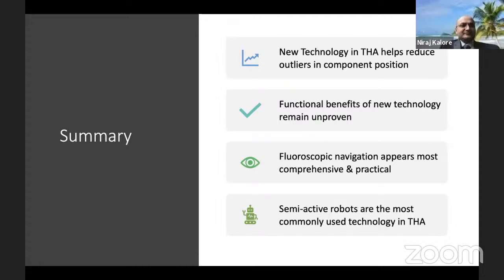Probably different. And out of the new technologies that you mentioned, what is the one that you use or would prefer in your OR? So we have the Velys navigation that is ready for use this year, and the small robot would come this year as well. Not the Mako actually, it's the Velys, the smaller robot from J&J.